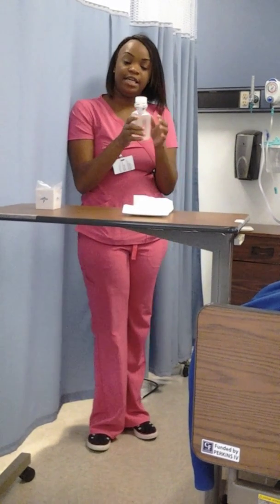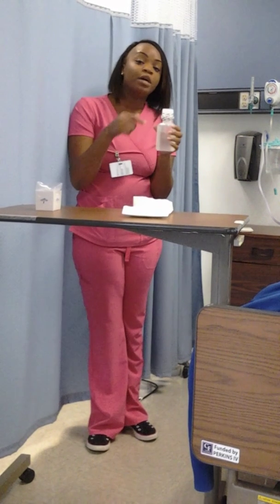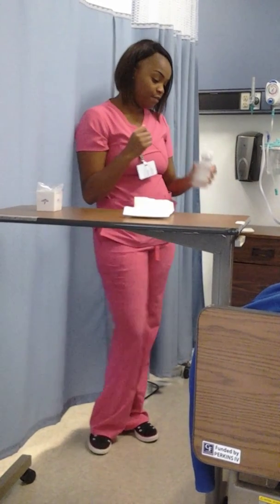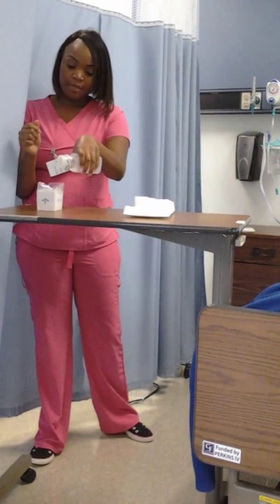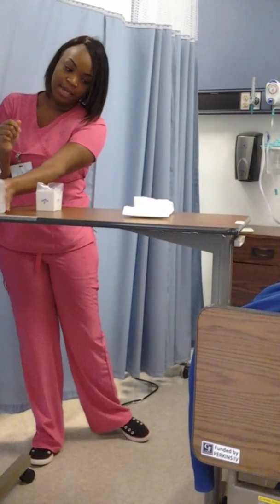I'll open up my saline. Even though it's brand new, I'm going to just go ahead and lip it just to be safe. Have my garbage can here. I'm just going to lip it. Now I'll go ahead and pour some of the saline in. Get it out of the way.